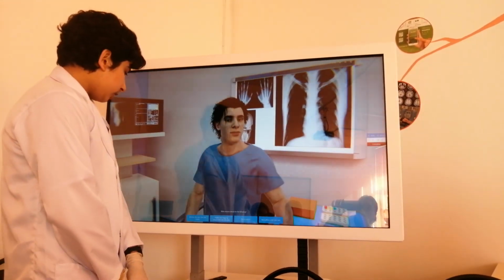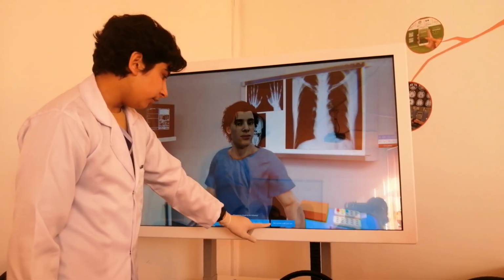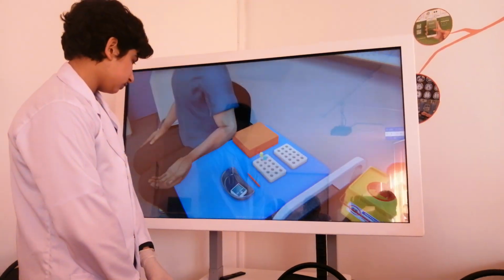Remove the tube from the holder. Make a few wiggling movements with the tube. Put on gloves. Put a pillow under your arm. Under the patient's arm, place a rubber cushion.